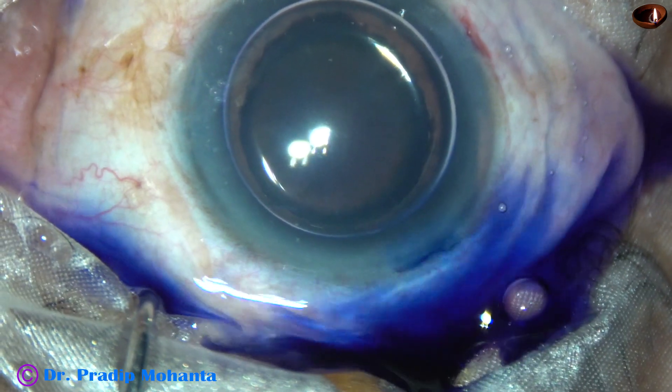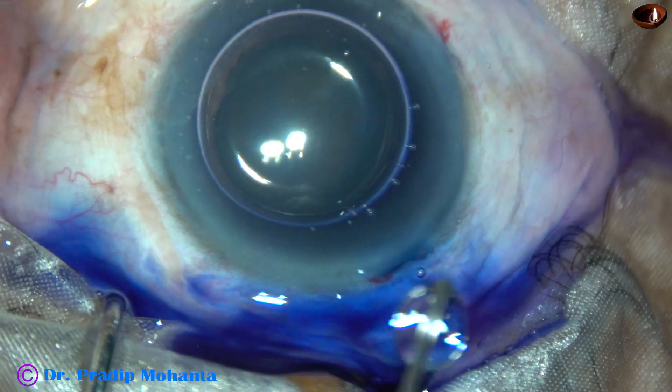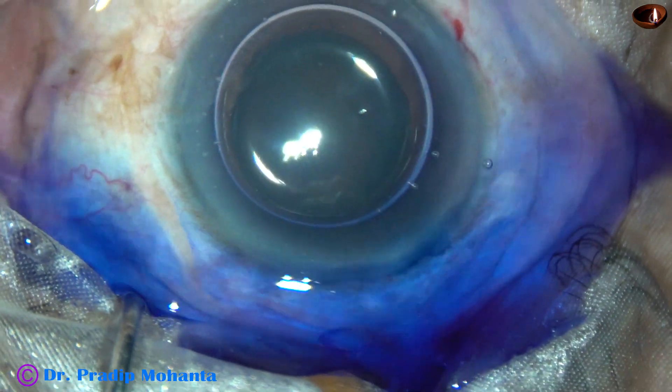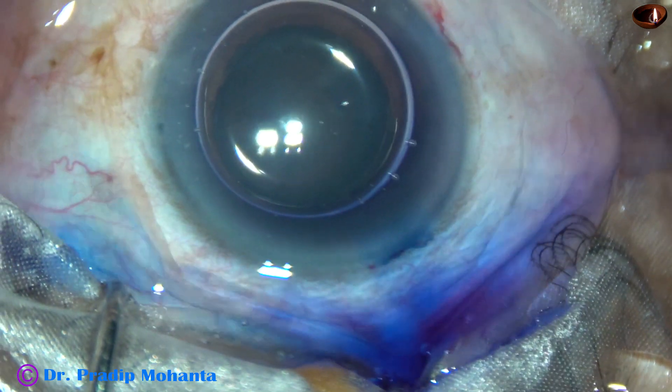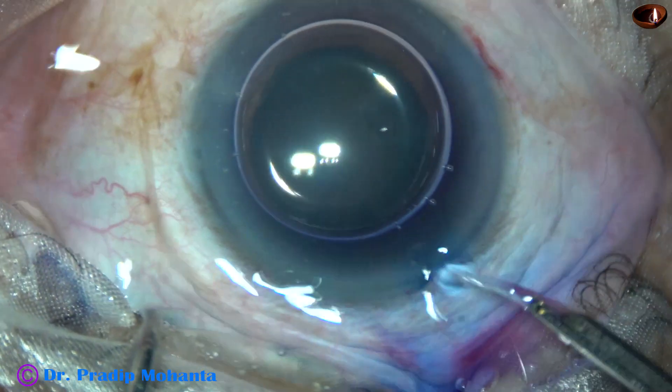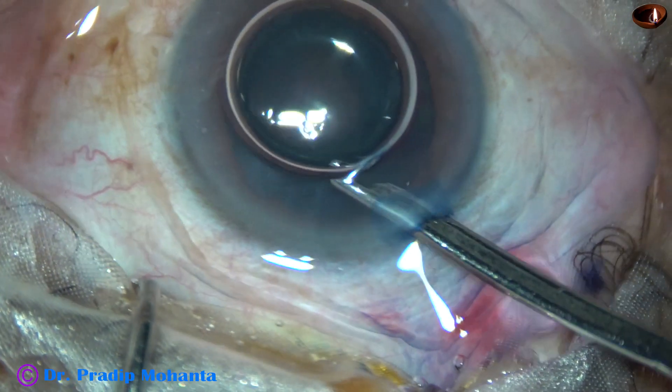The dye is applied in such a way that there is uniform staining of the anterior capsule. This is a bit of adrenalin to see if the pupil dilates a little more. Now the dye is washed out with BSS.